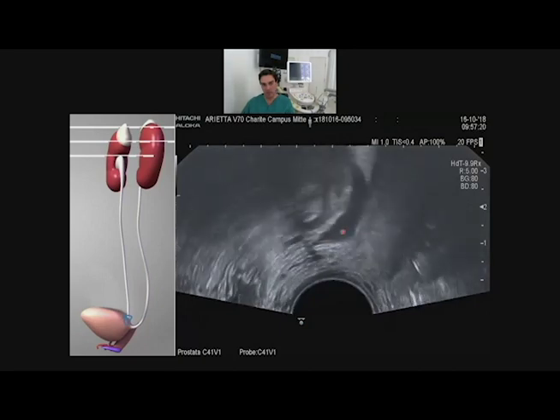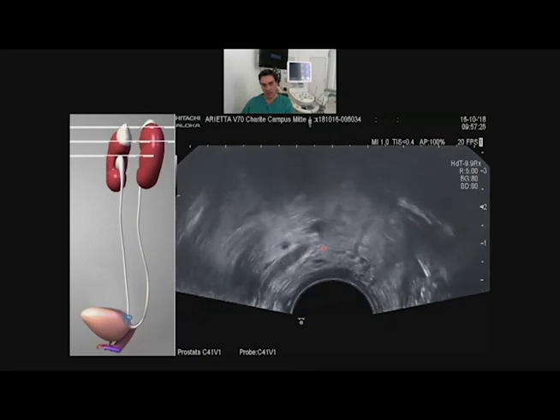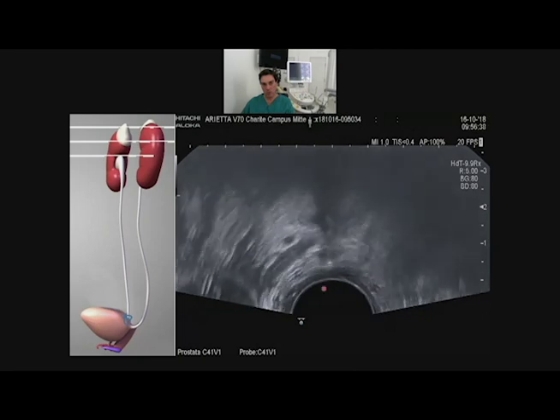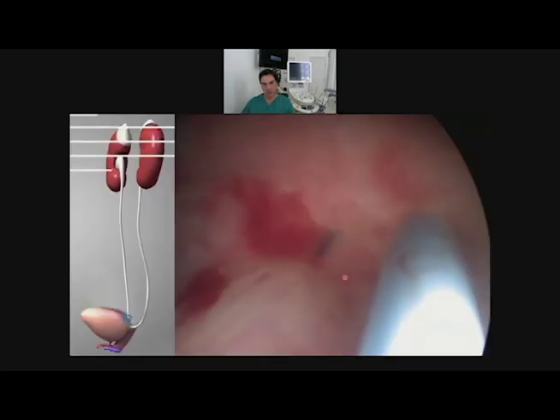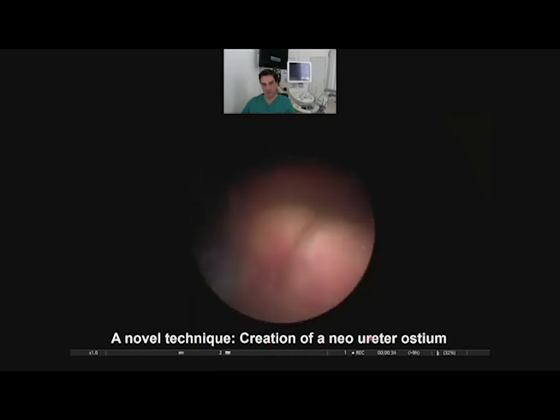Suture, hydronephrotic ureter. It's dilated here. There's a stopping part. And what we do now is to find a way and to create a neo-ostium. Really simple to do. You see it with a scope. This is the bladder. They sutured it through. The ostium is totally sutured more than one time. Really nice to see here. And we go inside.